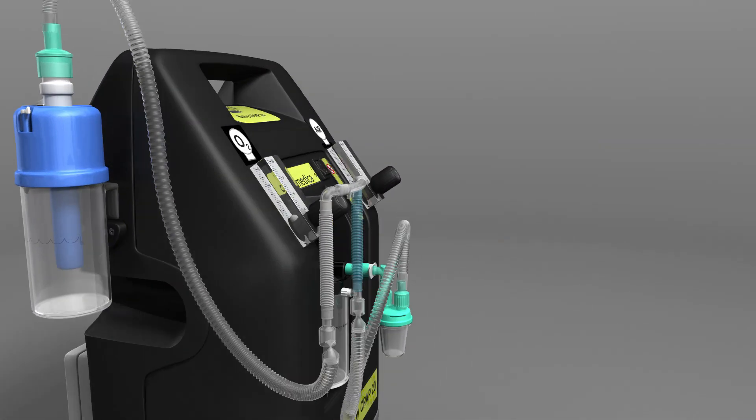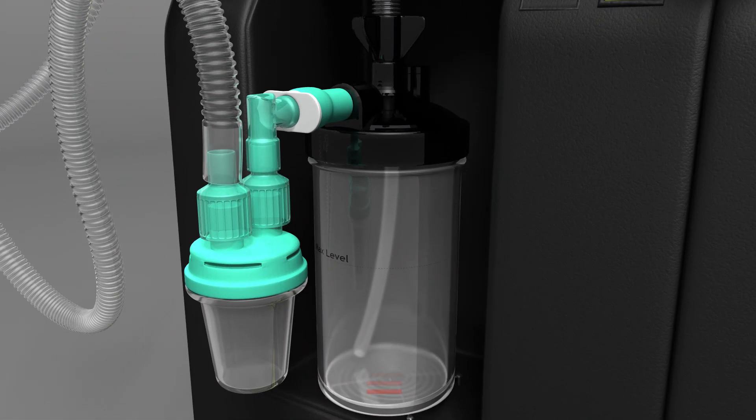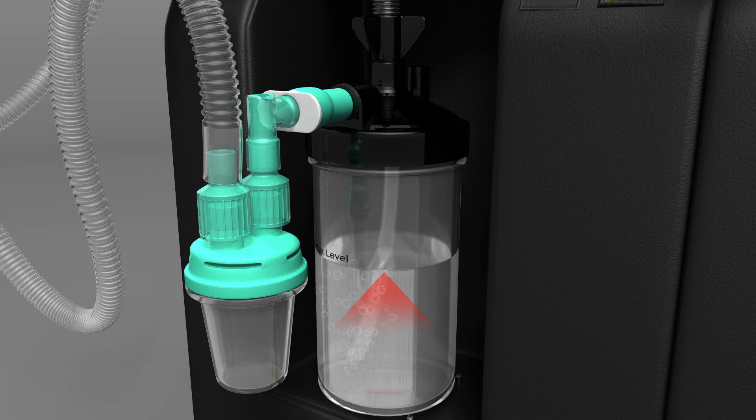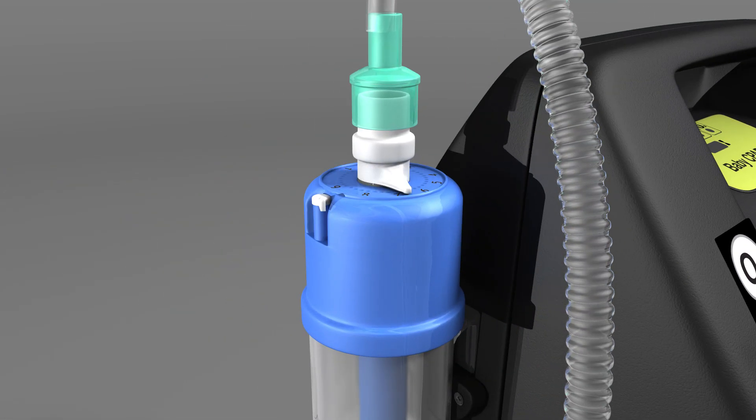This unique design produces high flows of oxygen and air from the atmosphere using a modified oxygen concentrator. The gas is warmed and humidified, and the pressure is controllable from 1 to 10 centimetres of water.